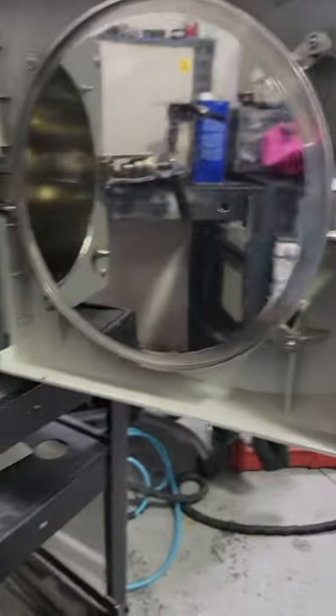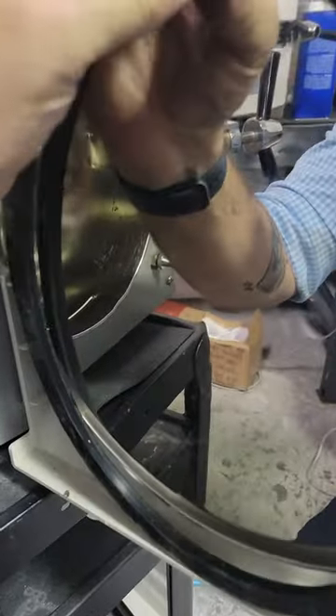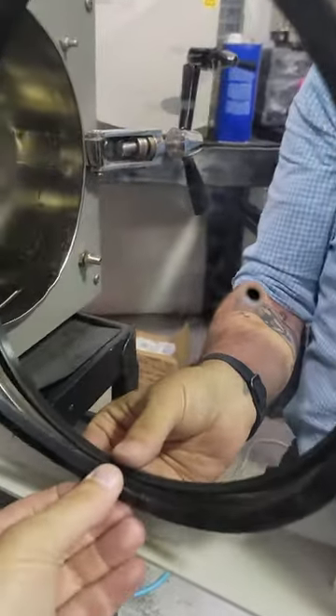How to replace a Tatenauer door gasket. There's a big side and a little side — big side goes in, little side stays out.